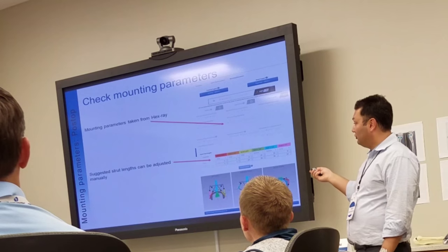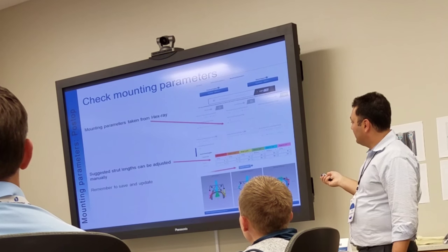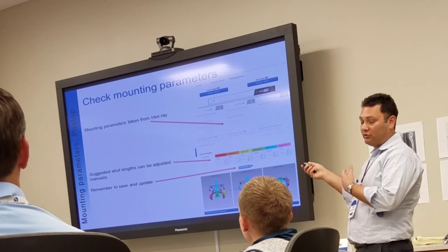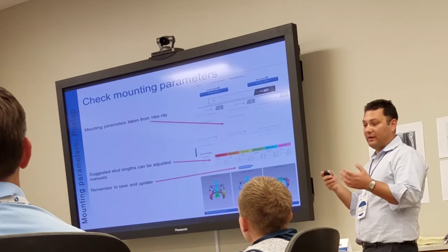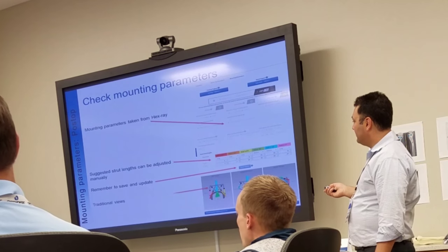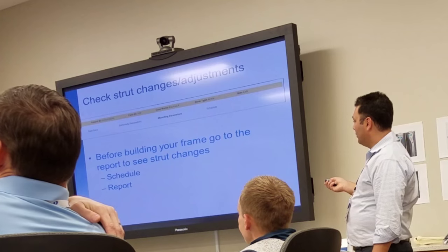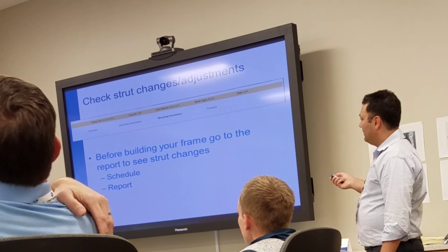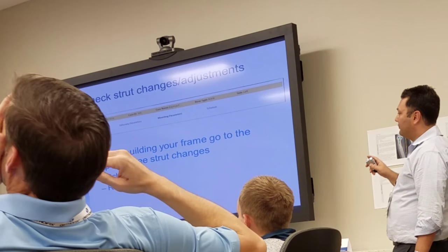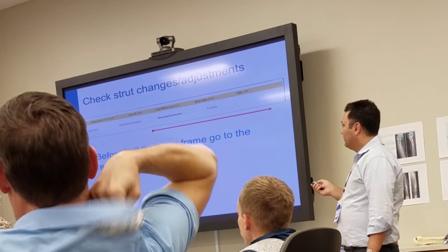You can adjust your strut lengths — if you feel like a strut is too long or you want them all the same size, you can adjust that. Save and update it, then you get your views back. Go to the end of the correction. Before you build your frame, go to the report and make sure to check your strut changes. Look at the schedule.